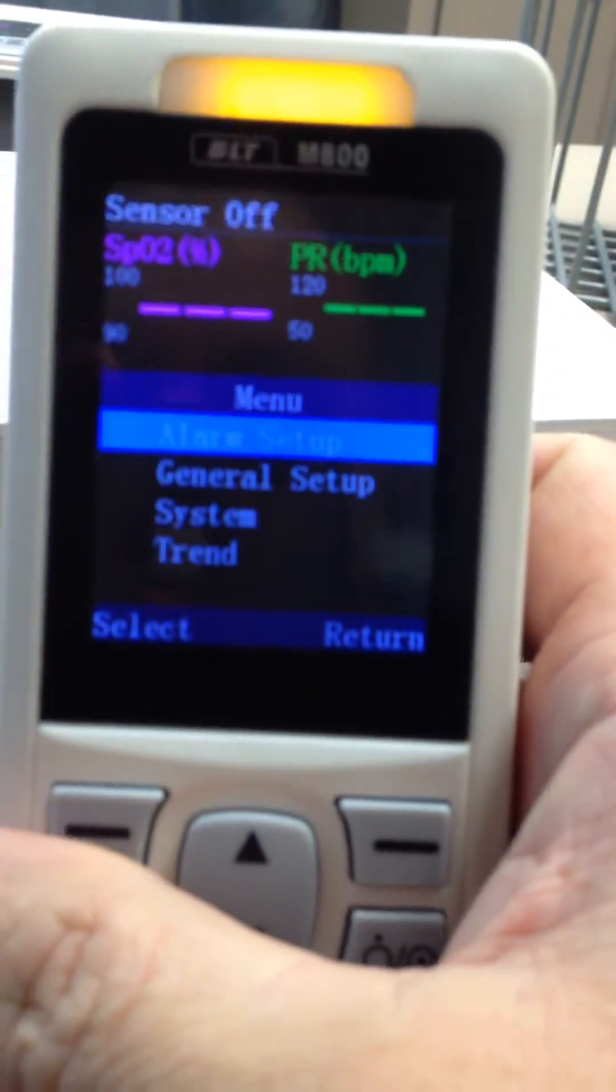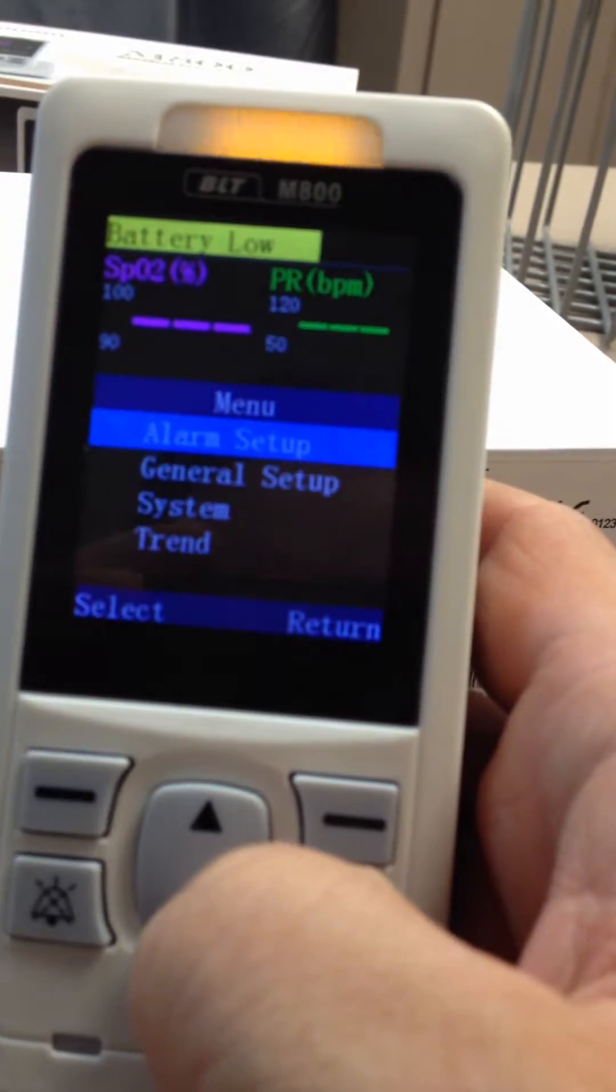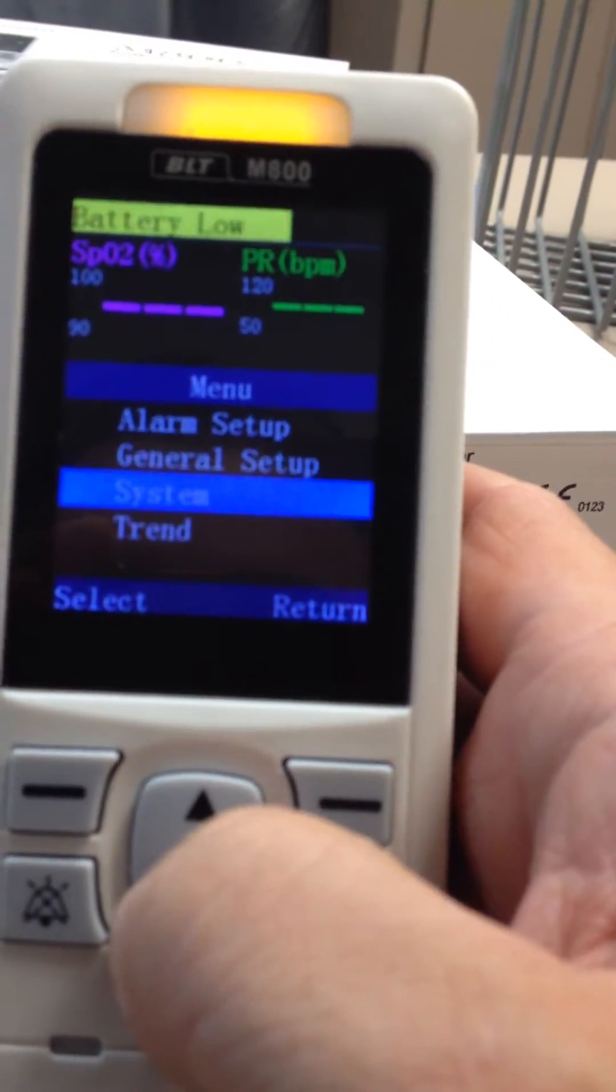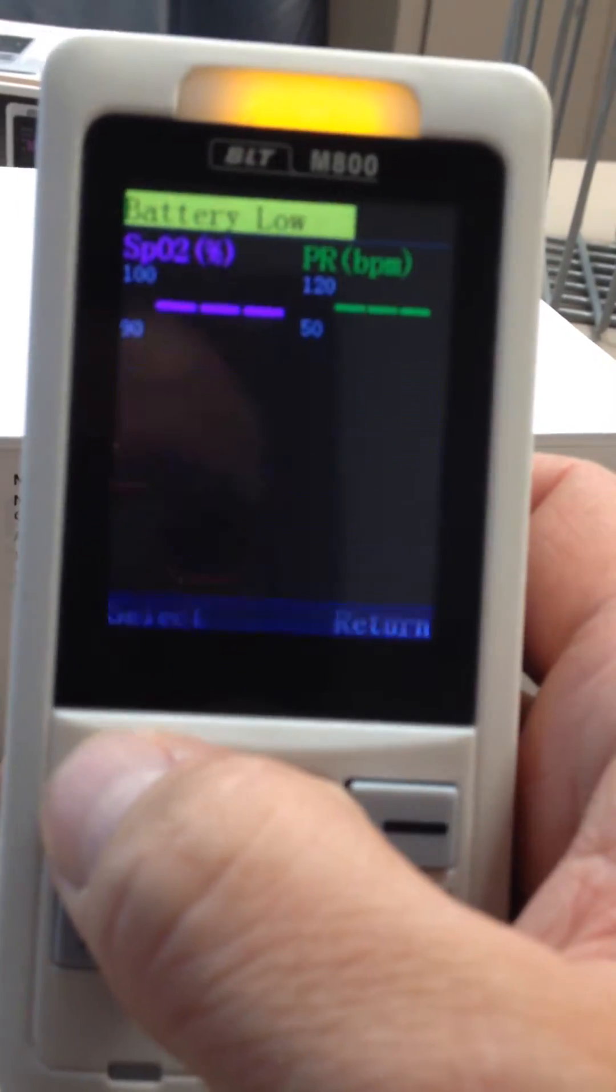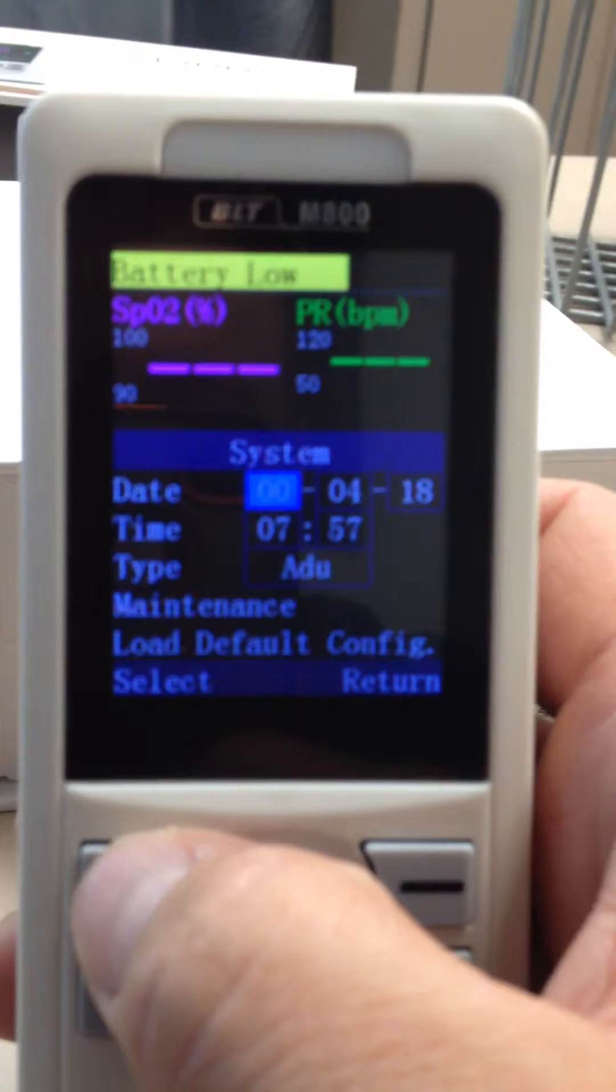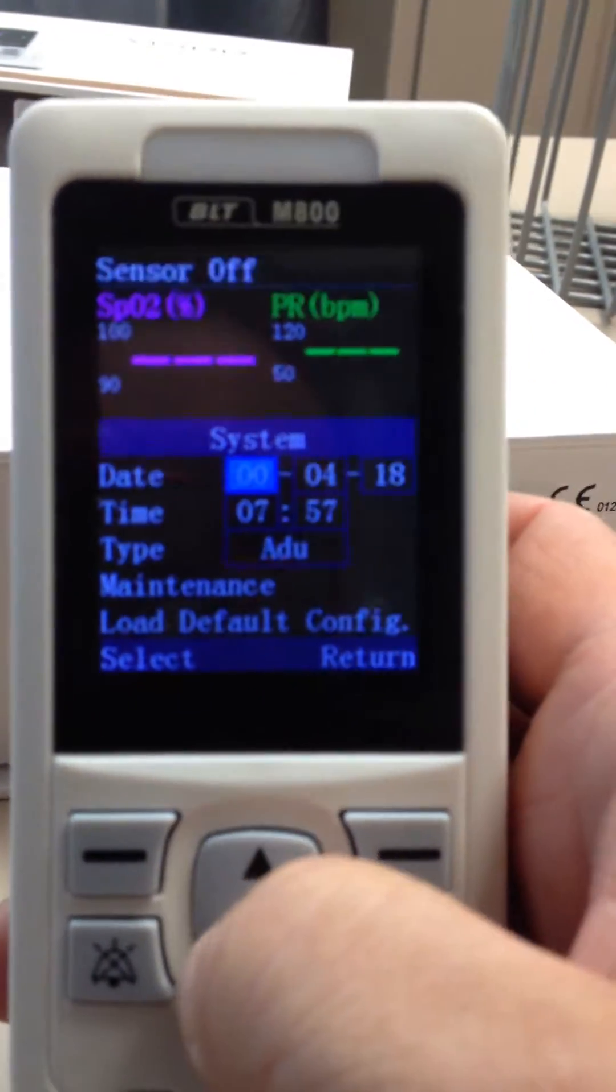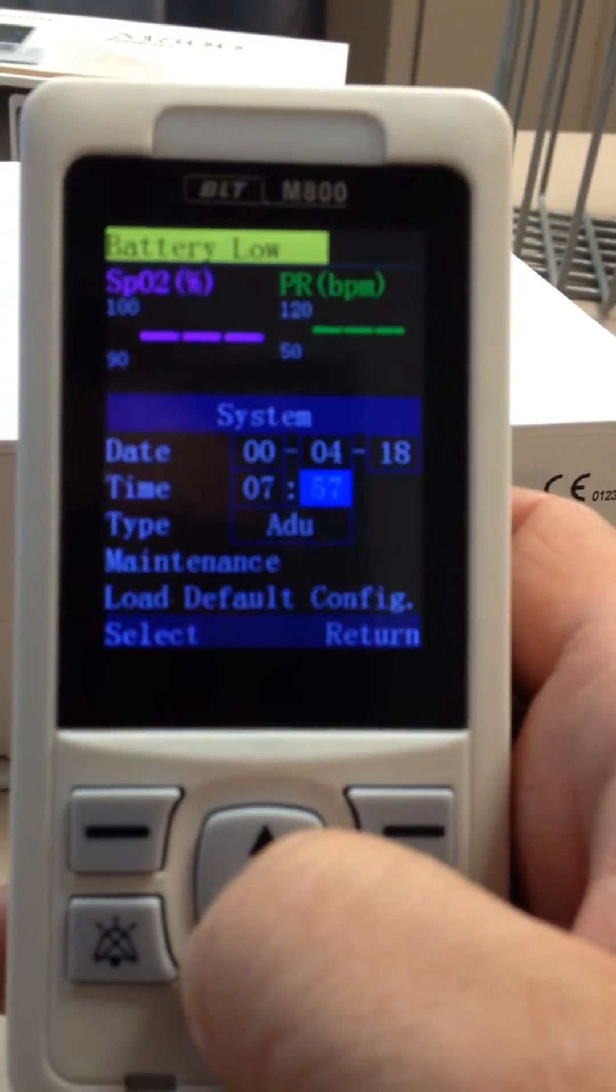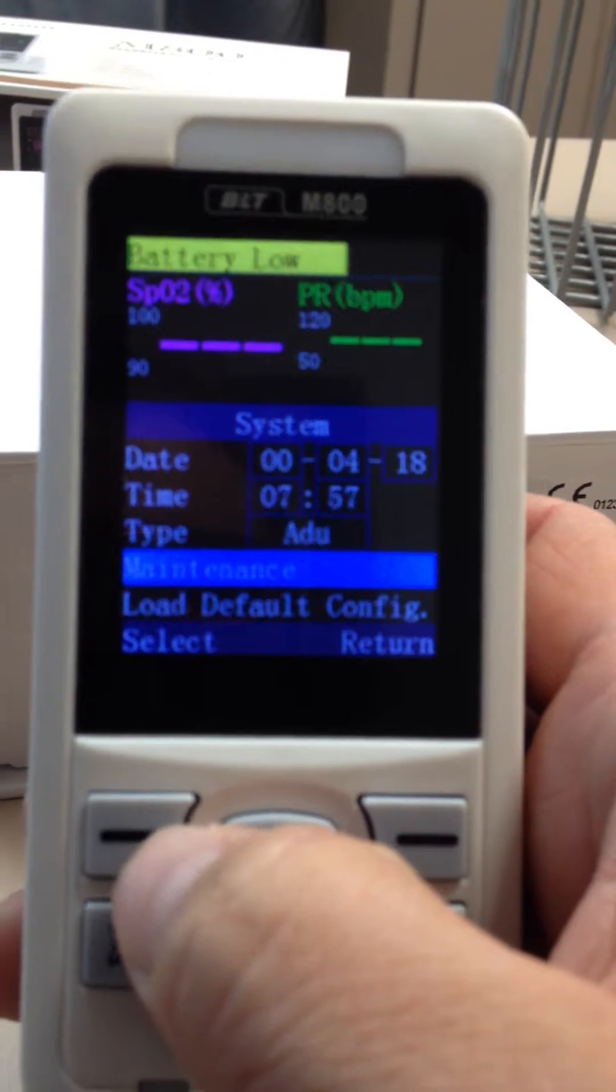You will come to this screen. Go down to System and press Select. Then go down to the Maintenance option and hit Select.